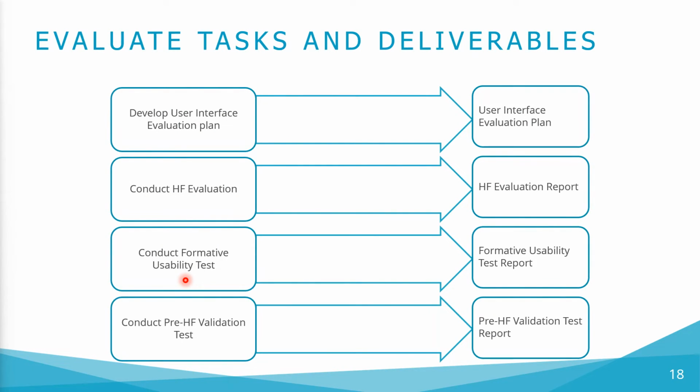For each formative usability test, we will develop a protocol to guide the test, conduct the test sessions, analyze the data, and finally develop a report that describes the test findings, for example, test participant interactions with and subjective feedback on the product and the associated recommendations for changes.